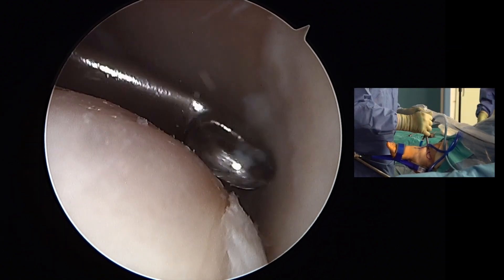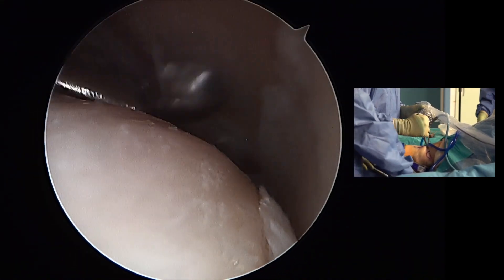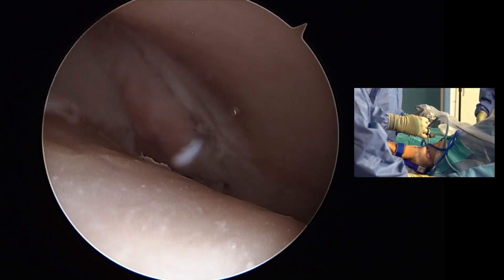For difficult areas such as the medial gutter, a curette is the instrument of choice. It is used to scoop out cartilage at all the corners and at difficult angles.